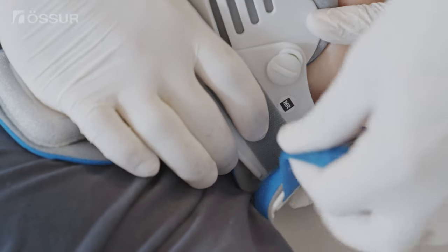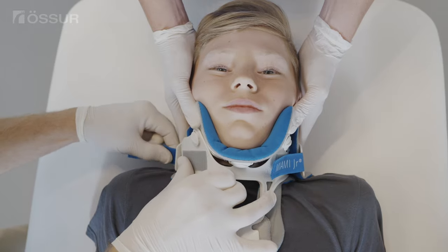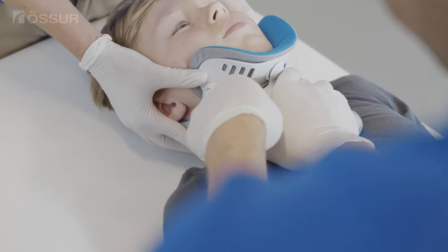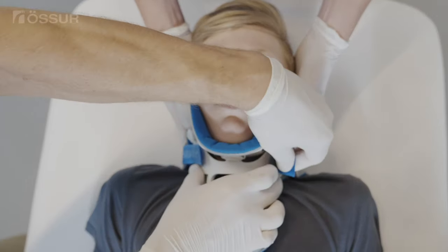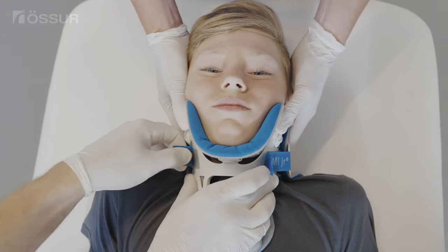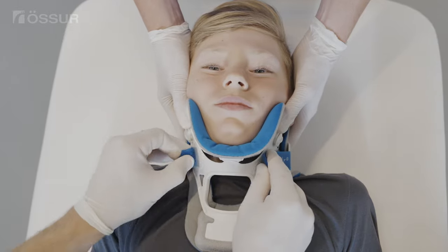While holding the front securely, curl the ends snugly against the patient's neck. With the front of the collar inside the back, apply the hook and loop strap and secure the opposite side of the collar in the same fashion. Tighten straps alternately to an equal length on both sides. Hook and loop straps must be aligned to the front adhesive sections. Excess may be trimmed.